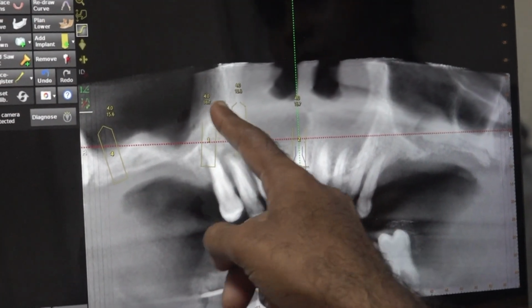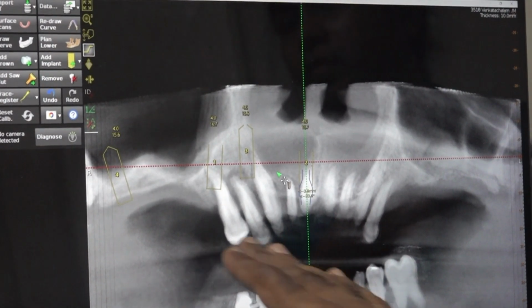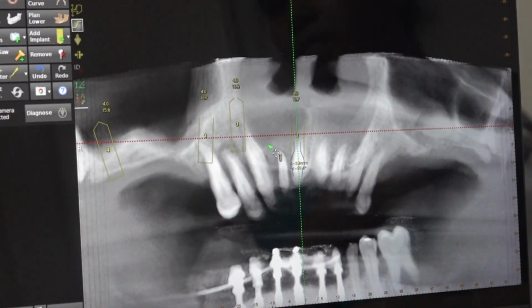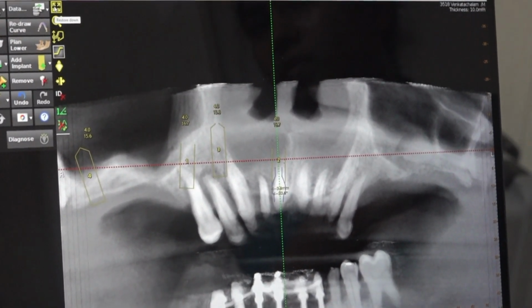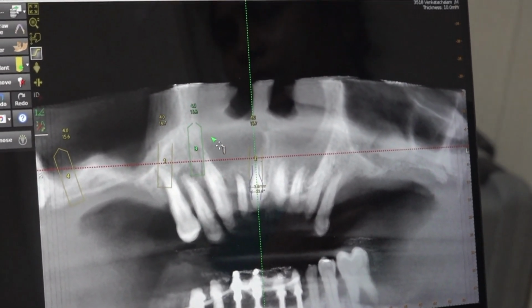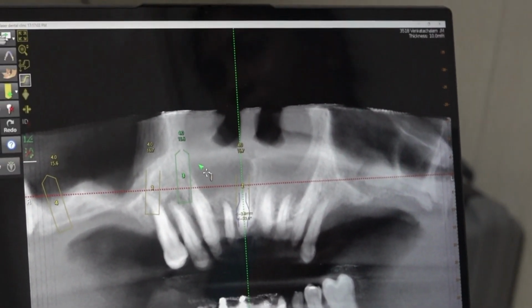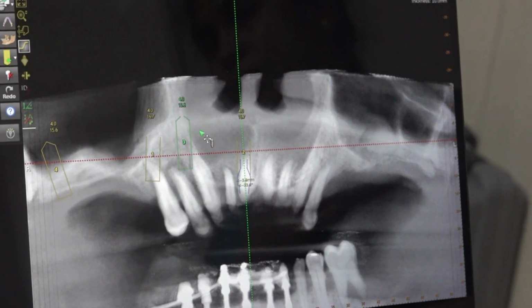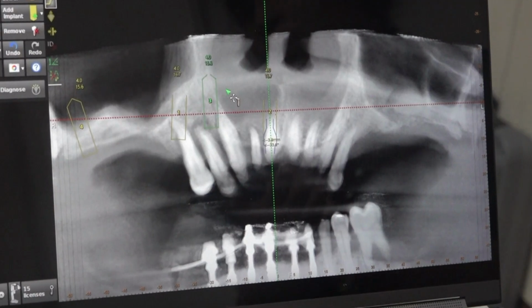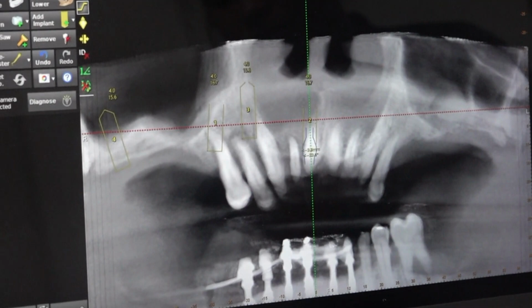You may feel, I will place one implant here, one implant here, one implant here, one implant here. But practically that is not possible. Here at the teeth level the arch form is very wide, but at the nasal level the arch form is short, it's constricted. If you don't understand and you place multiple implants, the inter-implant distance rule is compromised and you get very thin bone between the implants. Either you may luckily escape or bone loss may happen, implant failure or early loss may happen. Okay, these 3 implants are enough in the anterior area.